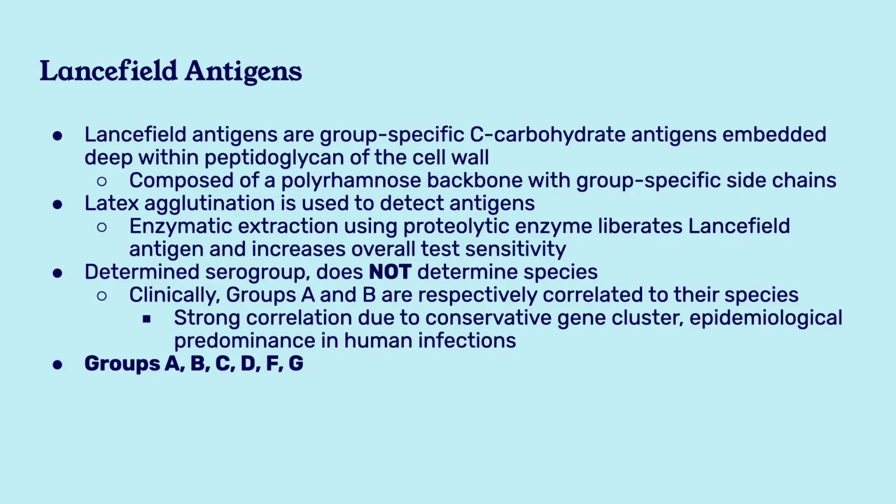Lancefield antigens are group-specific C-carbohydrate antigens embedded deep within the peptidoglycan of the cell wall. They are composed of a polyrhamnose backbone with group-specific side chains for each group. Latex agglutination is used to detect the antigens, and enzymatic extraction using a proteolytic enzyme is generally performed because it liberates the Lancefield antigen and increases the overall sensitivity of the test.